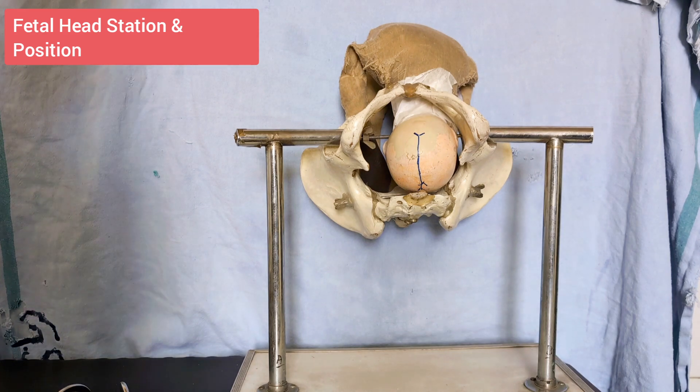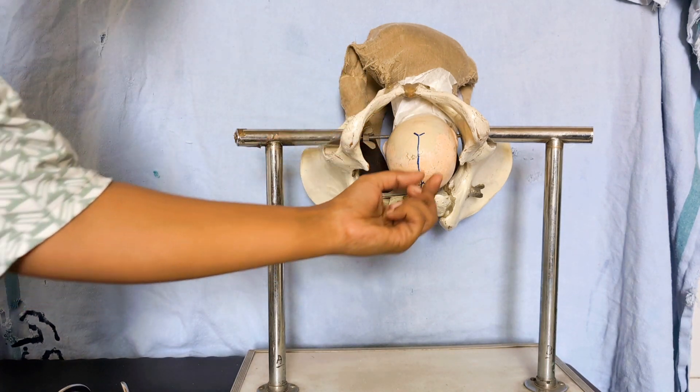Coming on to positioning — place your patient in the dorsal lithotomy position or in stirrups. Clean the perineum and drape accordingly, then empty the bladder. Now confirm the fetal head position: the fetal head should be at the perineum, or the fetal skull has reached the pelvic floor.